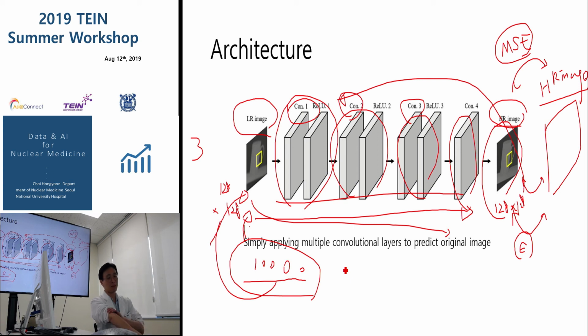However, some papers said that these high resolution techniques can reduce the PET dose by 200 times. So I think it's very innovative. However, there are several steps before convincing this into routine practice, because this recovery algorithm sometimes generates new noise at the edge of the images, some unknown noise. So we cannot differentiate the unknown noise from the deep learning generated noise.